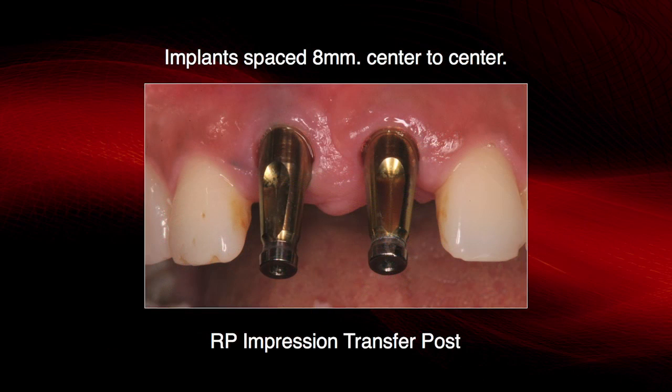So the next case, illustrating a custom abutment and keeping the gingival margin in harmony. We see a patient that was in a bicycle accident and fractured number 8 and 9. They were unsalvageable, and so they were removed and 2 implants were placed. And here you can see at the impression appointment, again, we tried to preserve the soft tissue, keeping the implants away from the facial bone.